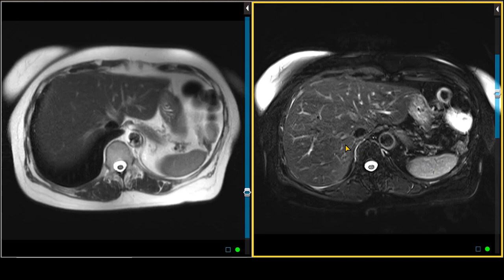In some instances, the turbo spin echo sequence is replaced by an axial echo planar imaging sequence. The advantage of doing it that way is that it can be performed more rapidly, providing a similar degree of tissue contrast.